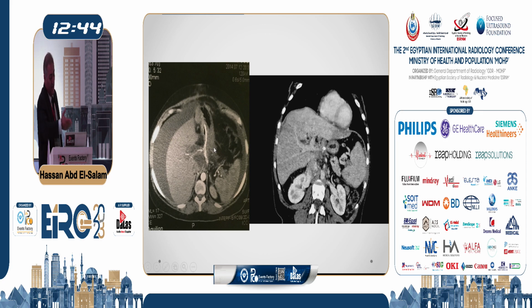I aspirated this ascites, which was clear ascites, went back through the images, and reconstructed them. One of the surgical clips is pinching the portal vein itself at the porta hepatis. So this is ascites due to portal hypertension rather than the previous ascites, which was due to direct biliary injury. During this surgery, the surgeon caused direct biliary injury, causing biliary leakage, and portal vein injury as well. And you can see here the portal vein is very narrowed at the site of the metal clip.